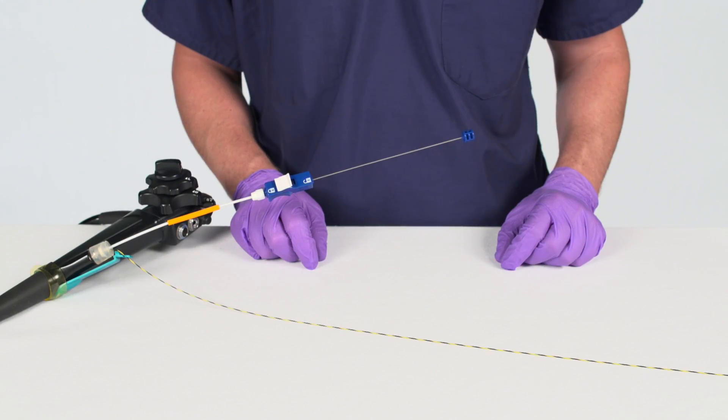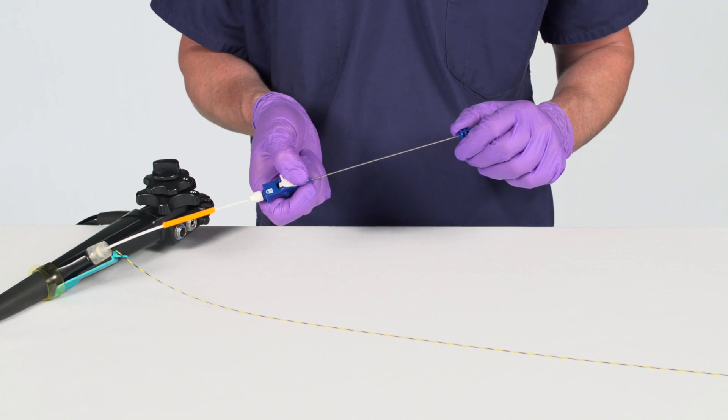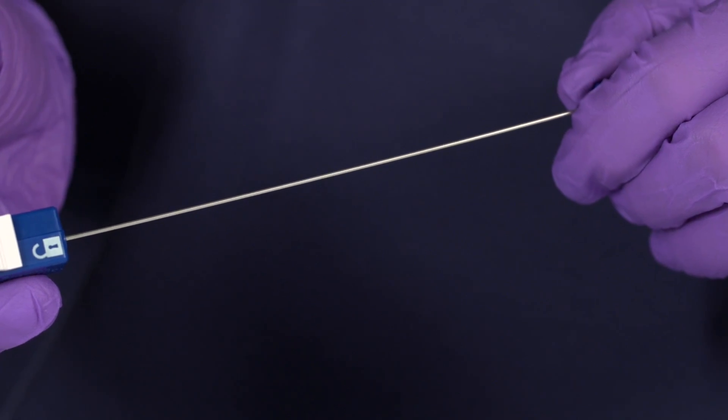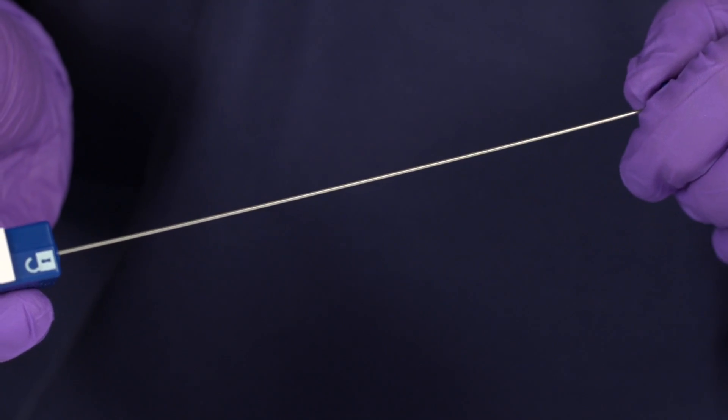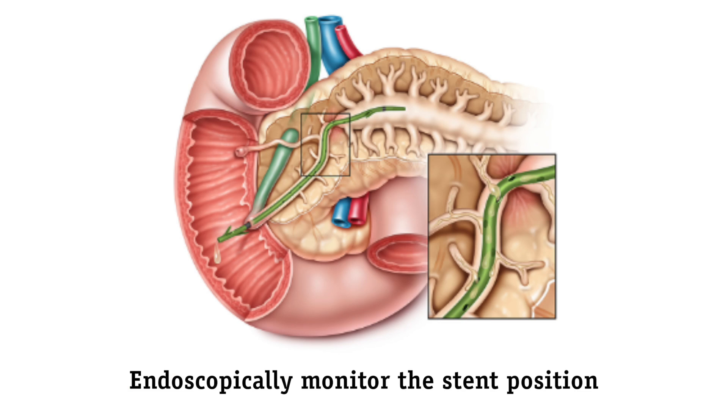To initiate deployment, ensure the Naviflex RX Delivery System Locking Mechanism is unlocked. Retract the guide catheter by pulling on the pull wire cap. The stent will be released when the guide catheter RO marker is aligned with the push catheter RO marker. Endoscopically monitor the stent position.